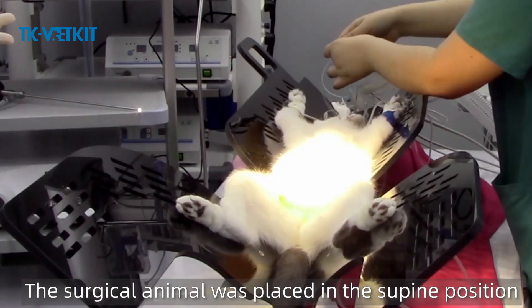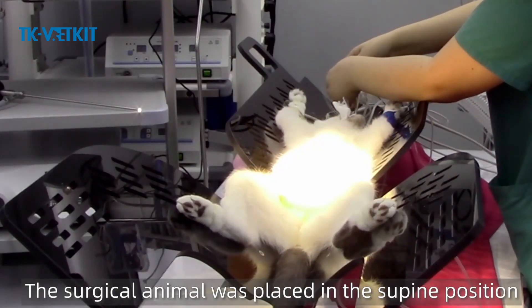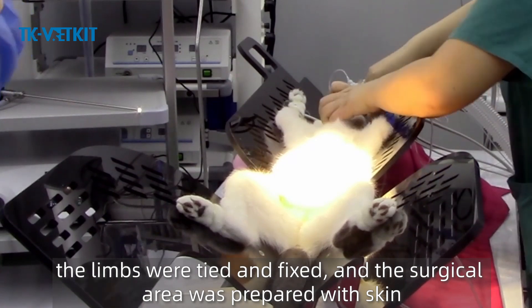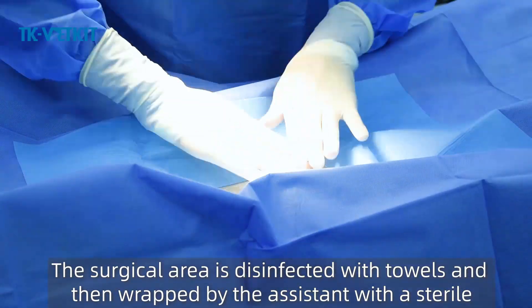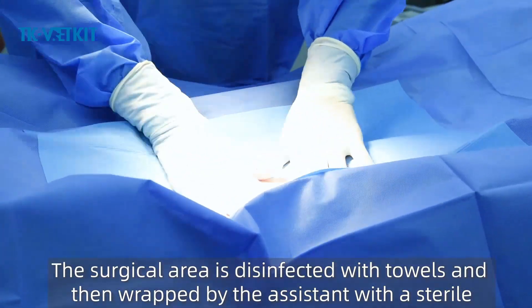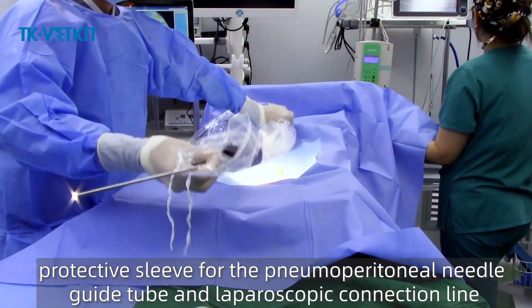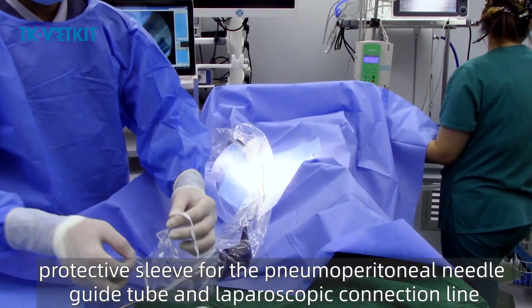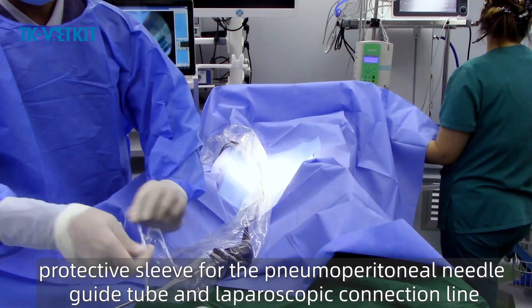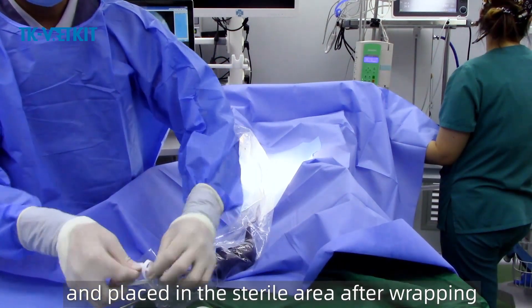The surgical animal was placed in the supine position and the limbs were tied and fixed. The surgical area was disinfected, then the assistant wrapped the pneumoperitoneal needle guide tube and laparoscopic connection line with a sterile protective sleeve and placed them in the sterile area.